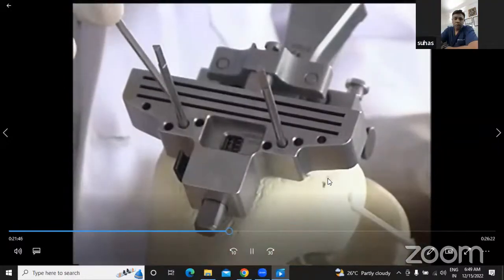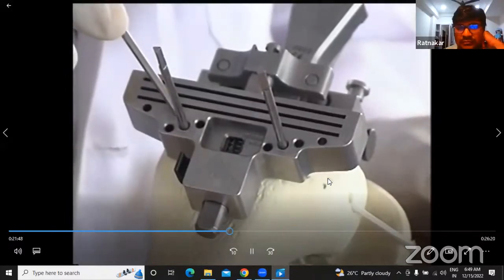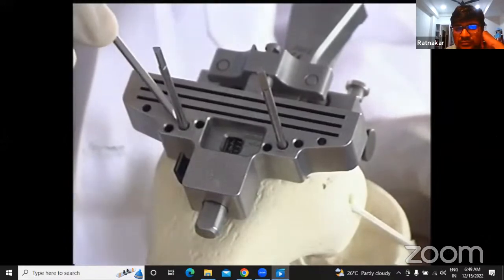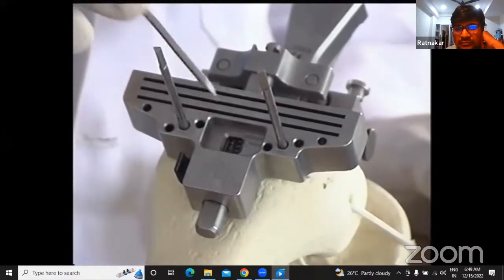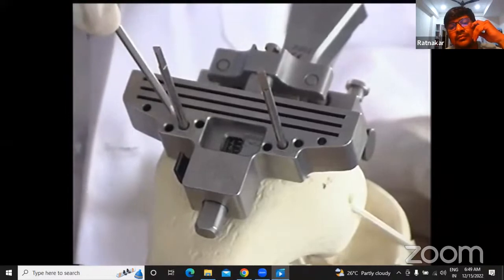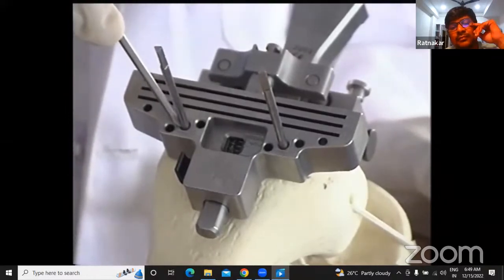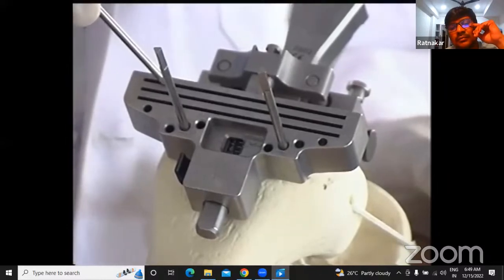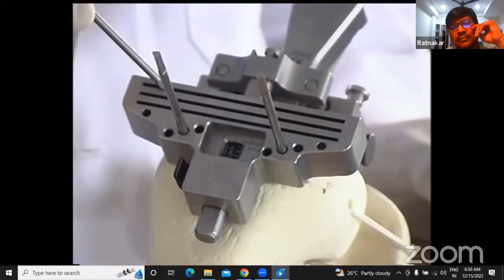If you look closely, that is the normal hole in which we put the pins. This is indicated by a square around the hole. So that means if you put this marker at 9 and put the pins into the square, and then cut into the most distal slot, then you are cutting 9 millimeters of the distal femur.